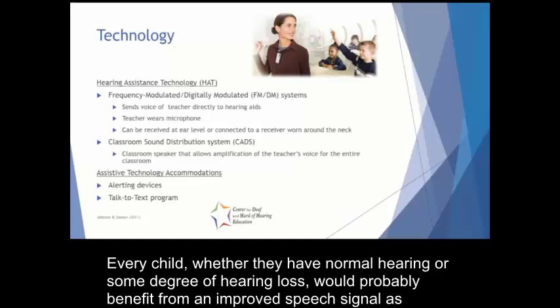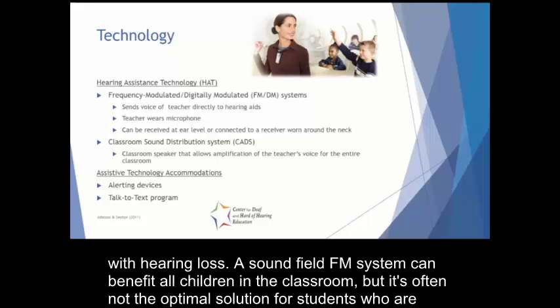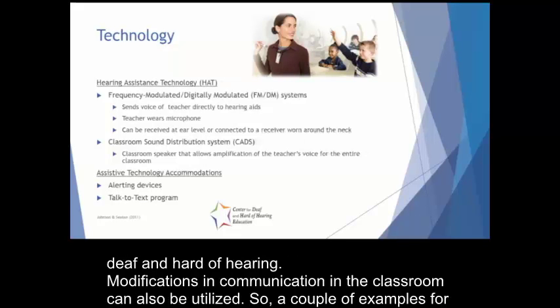Every child, whether they have normal hearing or some degree of hearing loss, would probably benefit from an improved speech signal as compared to background noise, because all children struggle to listen to noise as compared to adults. This is even more difficult for children with hearing loss. A sound field FM system can benefit all children in the classroom, but it's often not the optimal solution for students who are deaf and hard of hearing.